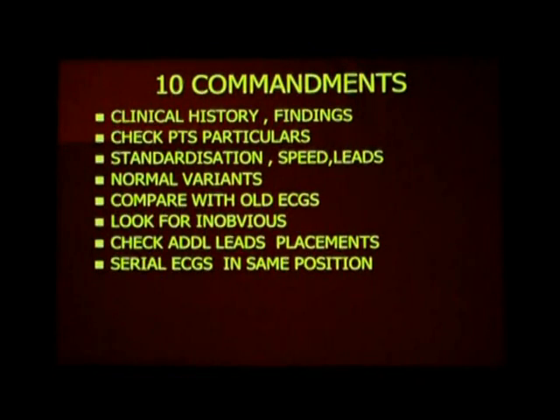For example, one day a nurse comes and takes the ECG on the neck. The other day the next nurse comes and takes the ECG on the abdomen. So you cannot take an ECG here and an ECG there and say the ECG change is a resolution and so on. It's a good practice to always mark the first ECG you take in ICU, where you are placing your chest leads. Mark those places in which you are taking the first ECG. Daily place the chest leads in that position and take the serial ECGs. Then only is there a point in comparing the serial ECGs, rather than comparing serial ECGs taken in different positions. So it's a good practice to mark the places of the leads you are taking.